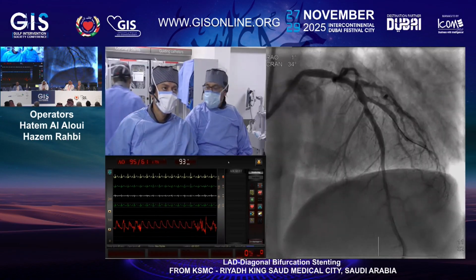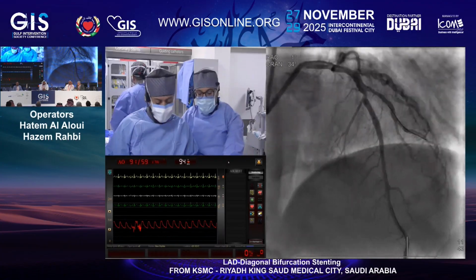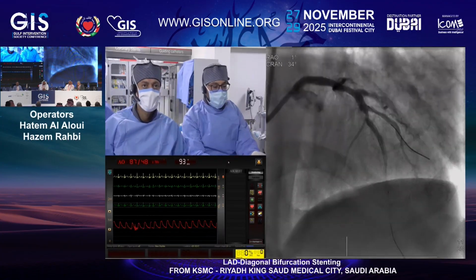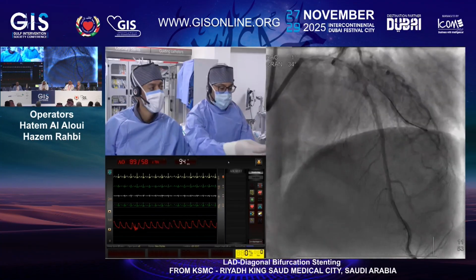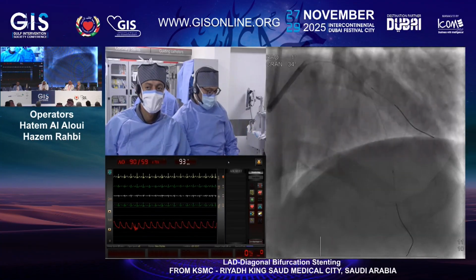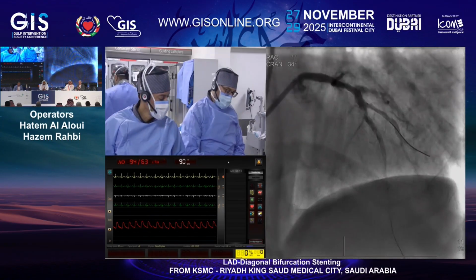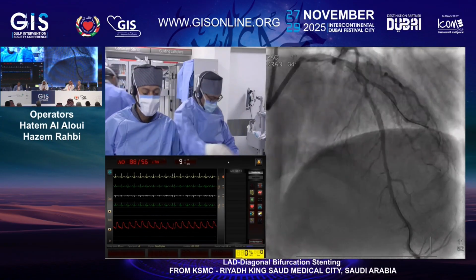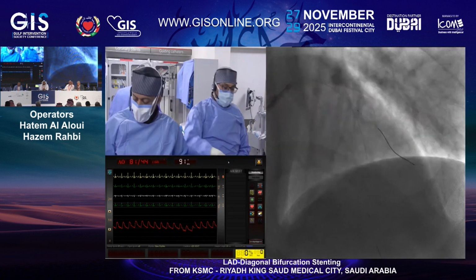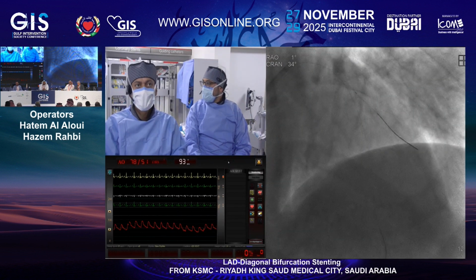Okay, Hazem, what's the balloon we take according to the IVUS? According to the measurements that we made, I think you can go with a 3.0 by 20 NC to start with. I think it's a little bit calcified as well. Probably, yeah, exactly. I think I'd go with NC, then I will use a cutting balloon. 3.5 cutting would probably be good. Can you give him phenylephrine? He's not tolerating the nitro.